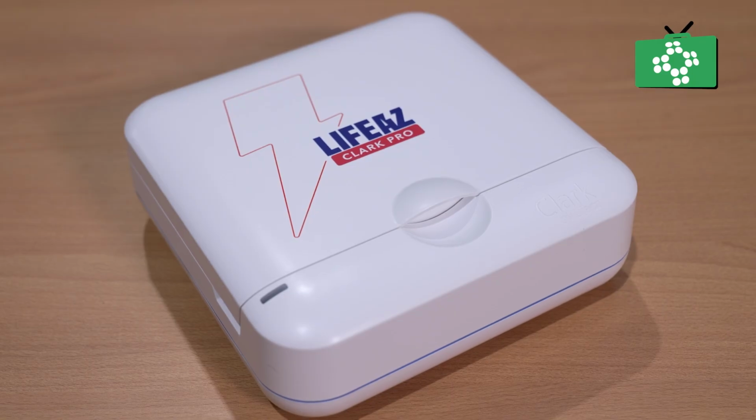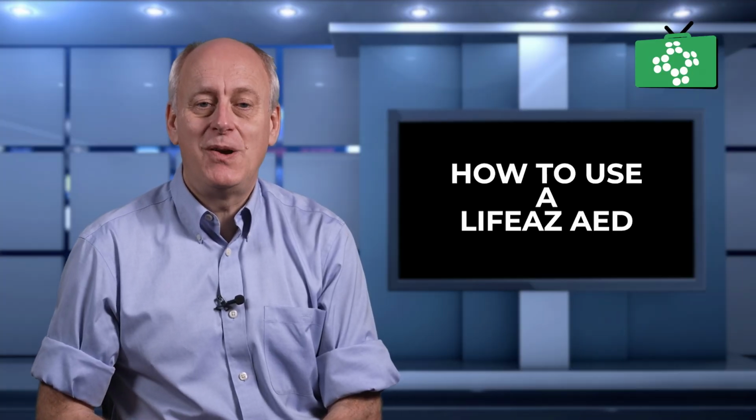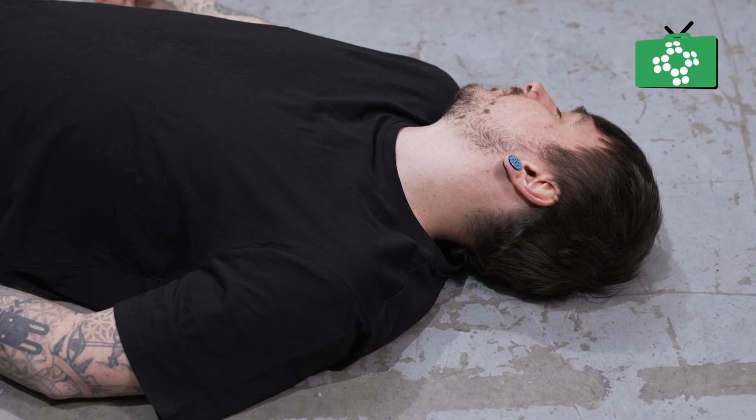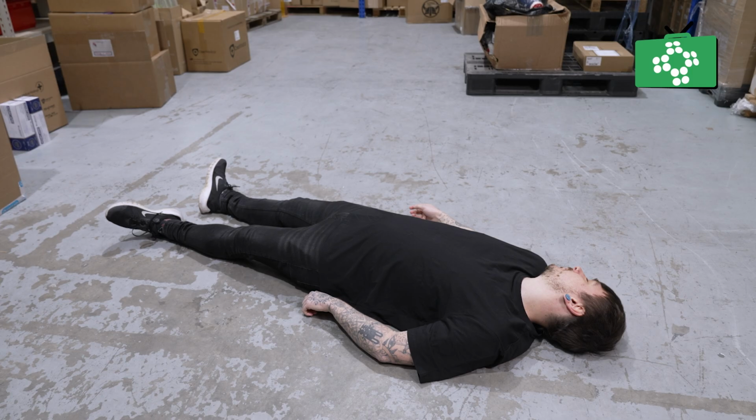We'll now look at how to use the fully automatic Lifeaz AED in a cardiac emergency. In this film, we're simulating CPR and AED use, as you never deliver CPR or put a live AED unit on a person unless there's a cardiac emergency. When you arrive at the scene and find a person unresponsive on the floor, we first need to establish what the problem is and follow these initial steps before using an AED.